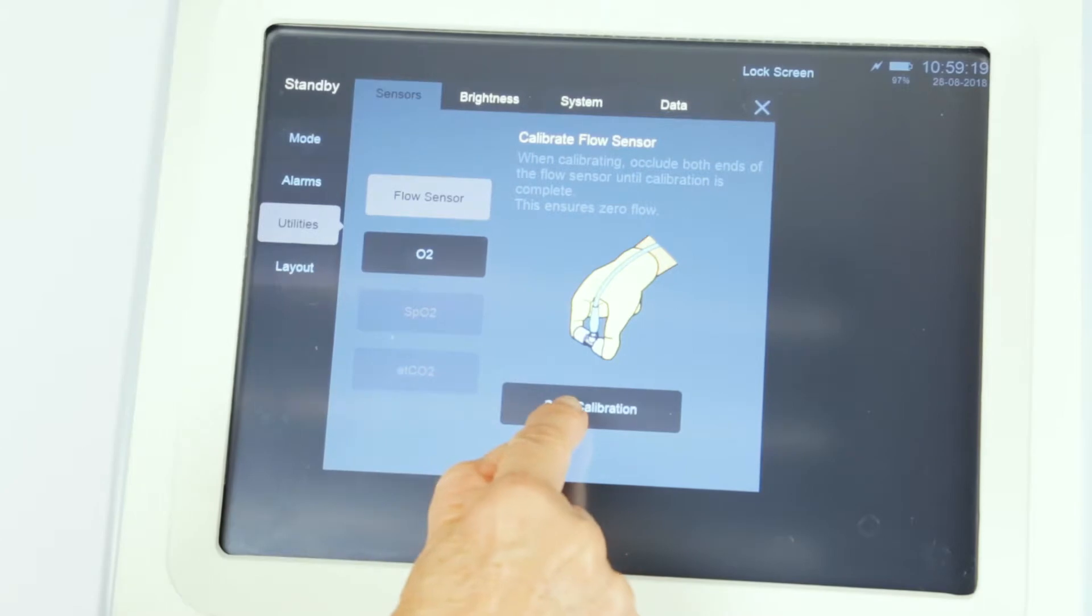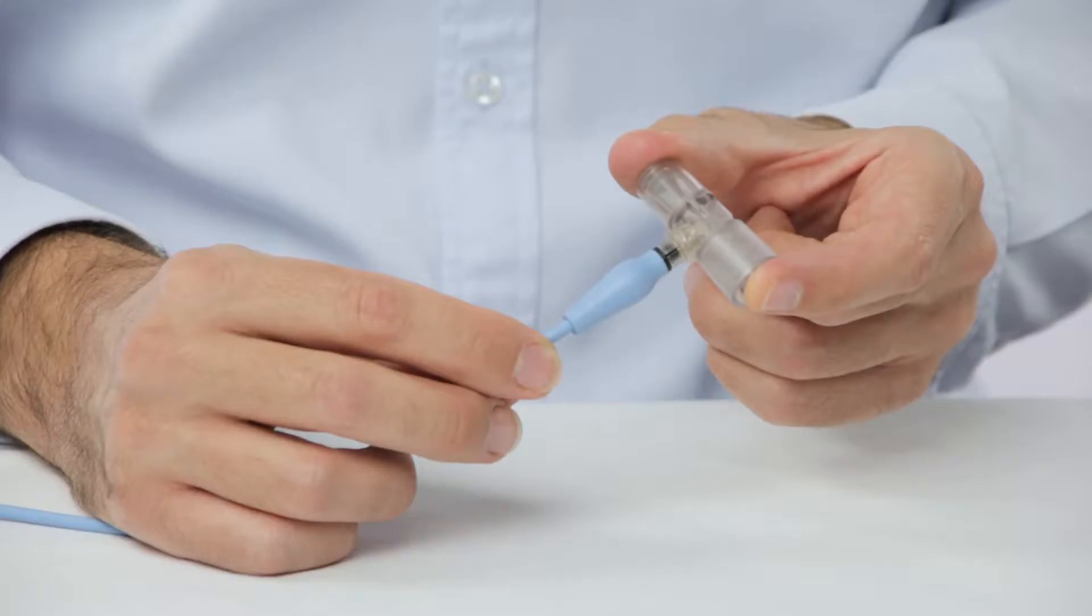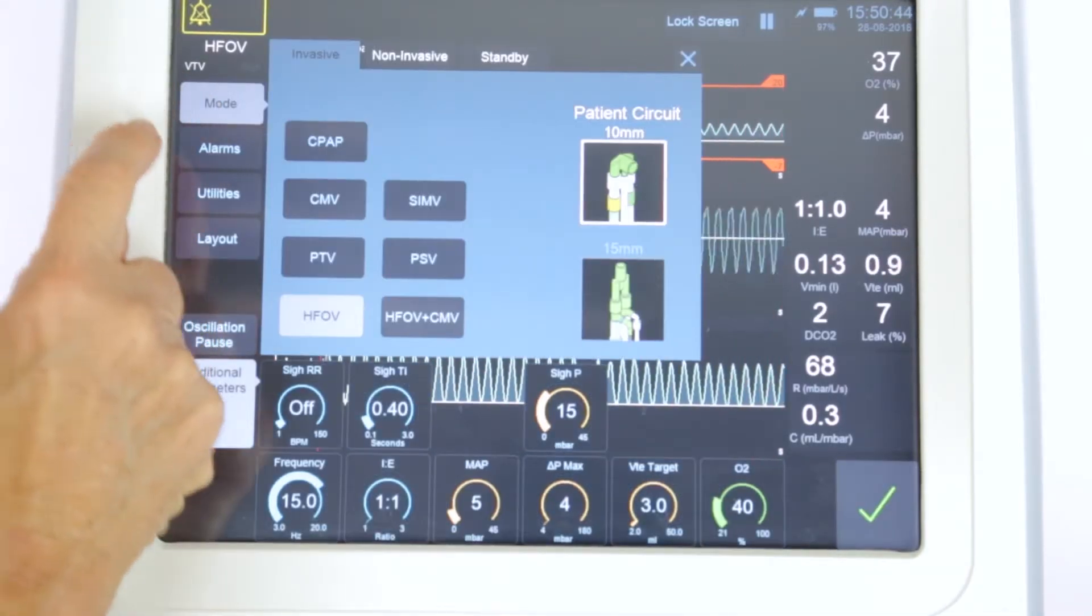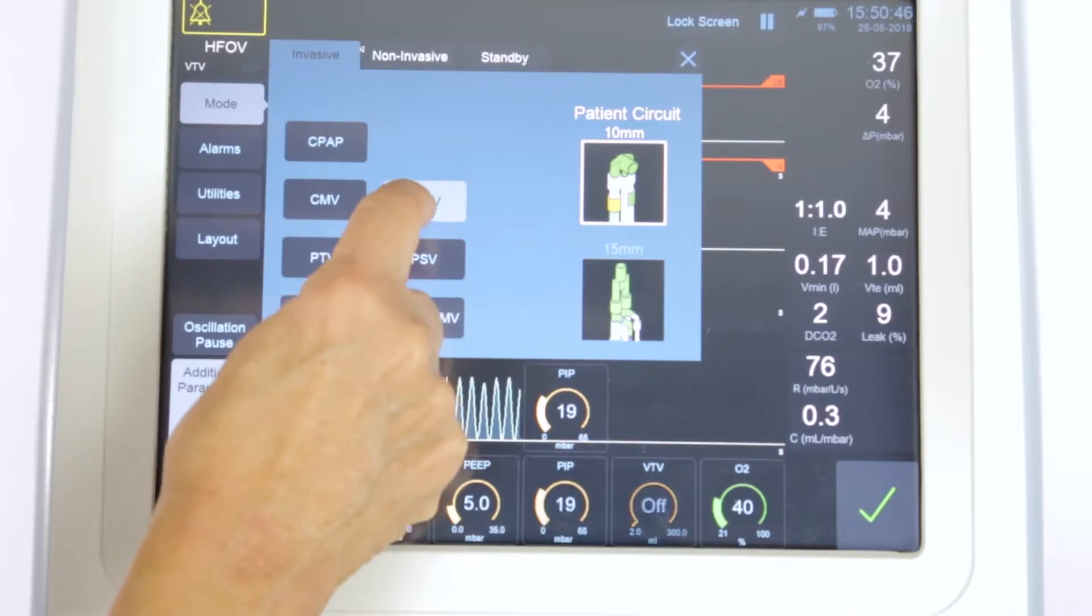Setting up SIMV. Once the flow sensor has been calibrated, go to the Mode Select button, choose Invasive Ventilation, and then select SIMV.